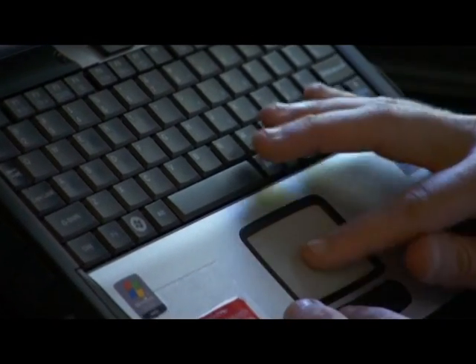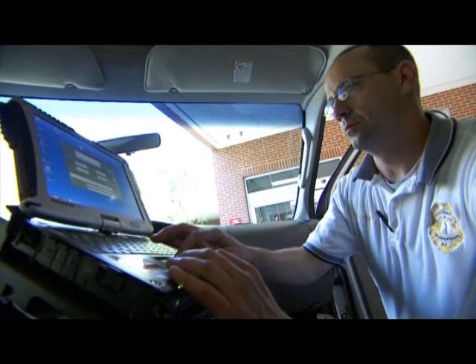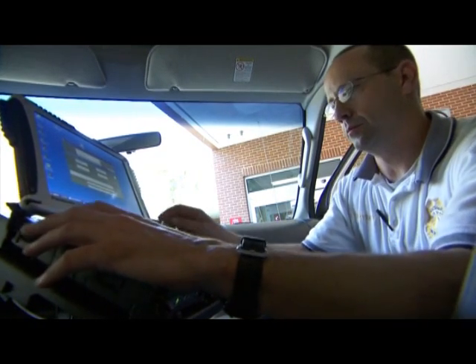Now that we're receiving the EKGs by ambulance transmission, we're already activating cardiology and the cath lab team, so when they pull up, the only thing we're doing in the emergency department is prepping that patient to go to the cath lab. The earlier we can determine if it's an actual heart attack or that cardiac muscle is being damaged, we get that to the hospital.